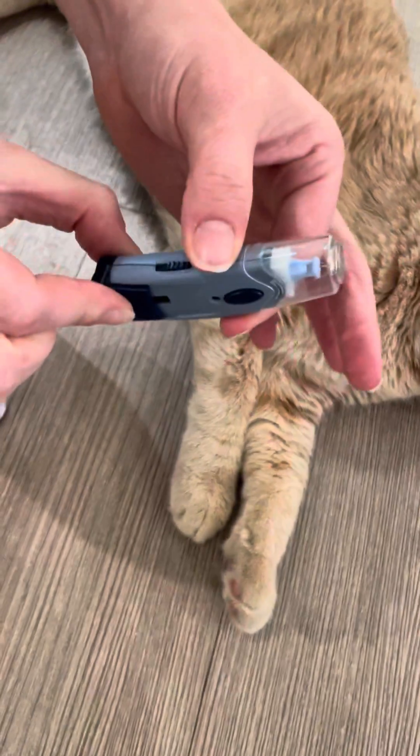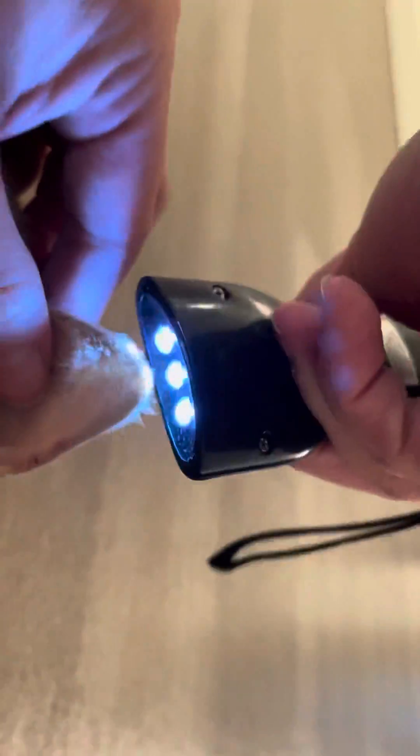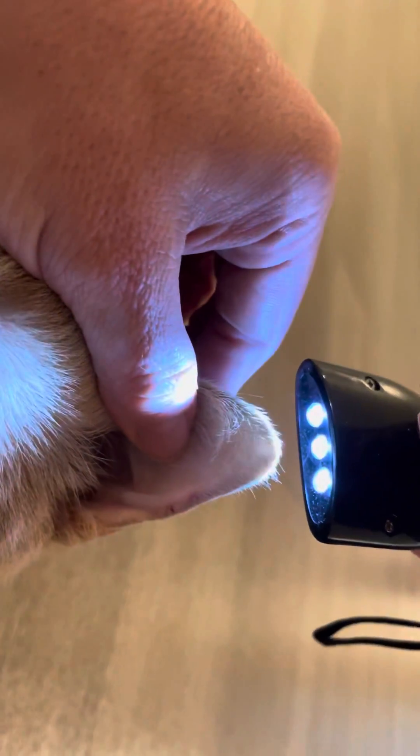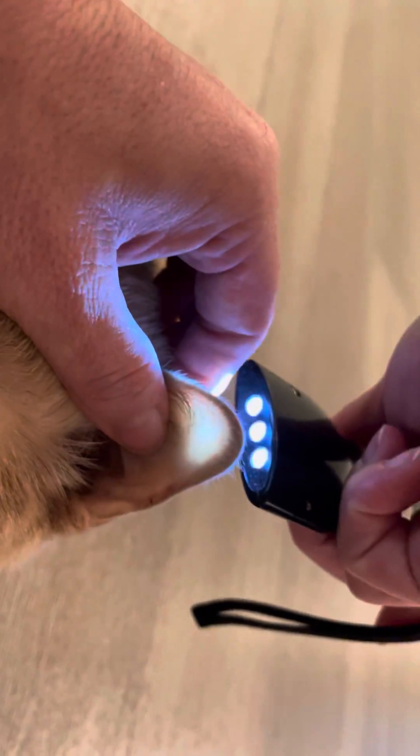You pull this back and then when you're ready you press this button. Cats have a vein in their ears, as you can see, along the edge, and that's what you're aiming for. You're aiming for the top.